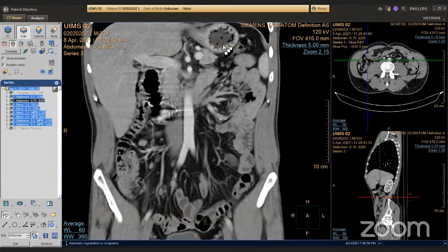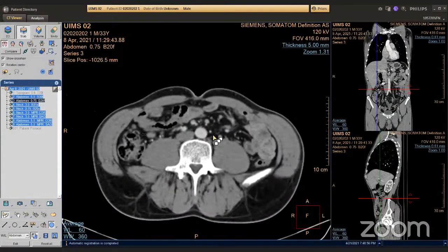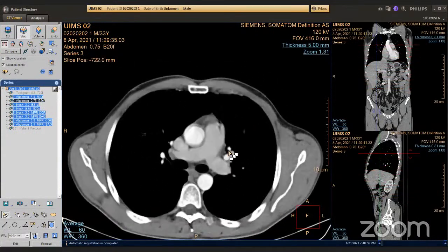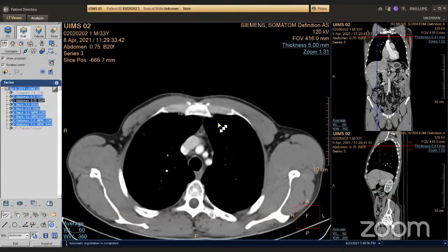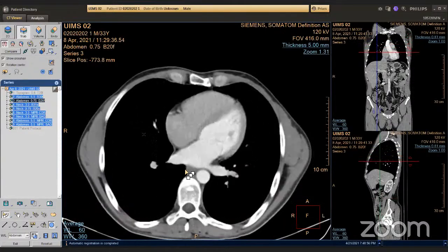Yes, there is. Okay, how to look for the lymph nodes? Is that the question you mean? Great. Lymph nodes are a tricky thing because on these sections, you usually find the lymph nodes because they are there and they just disappear when you go up and down, because they're just small things. Vessels that go up and down don't disappear.